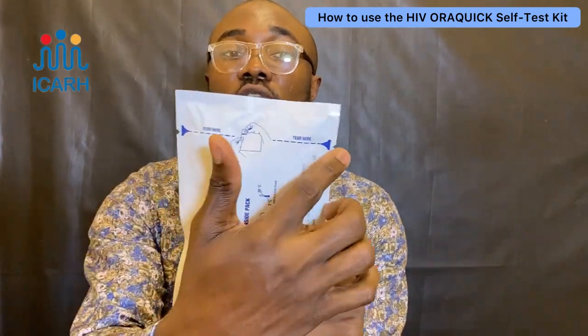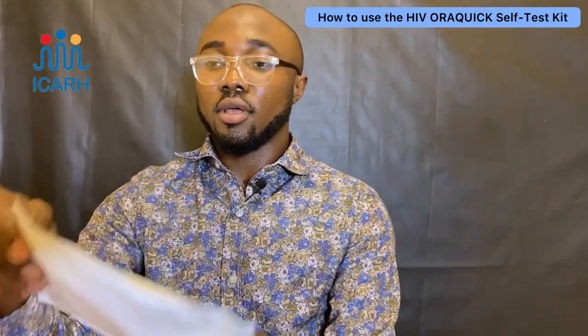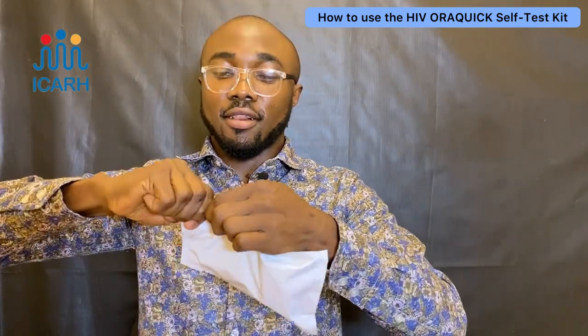On both ends of the test kit is where you tear from. As you can see, there's an arrow here and also here — that's where you tear from.